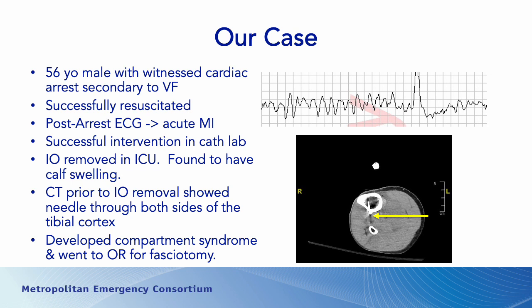So our case is really about a 56-year-old male, witnessed cardiac arrest. He was provided bystander CPR, and on EMS arrival, he was in VF. On the right, you'll see one of the tracings from the initial monitor setup. He was successfully resuscitated. He had a 12-lead ECG done after resuscitation, and it showed an acute MI. He was transported emergently and underwent successful intervention in the cath lab.